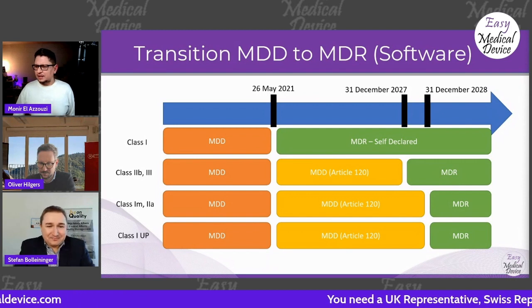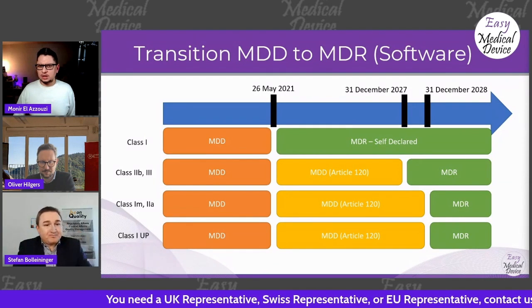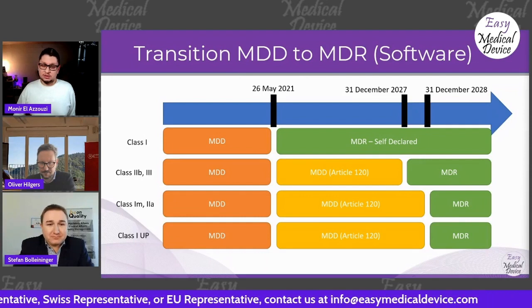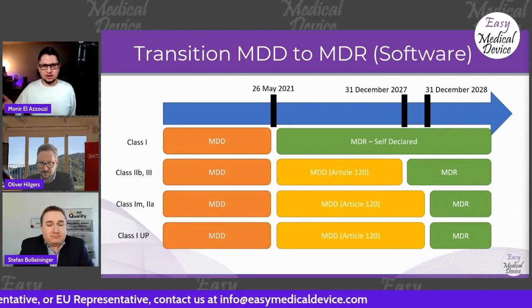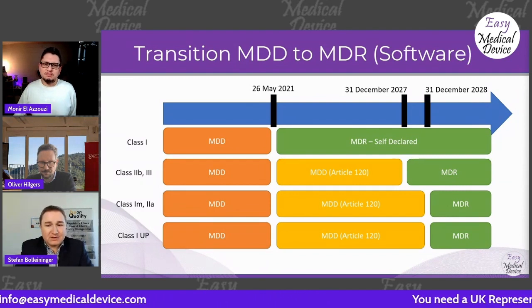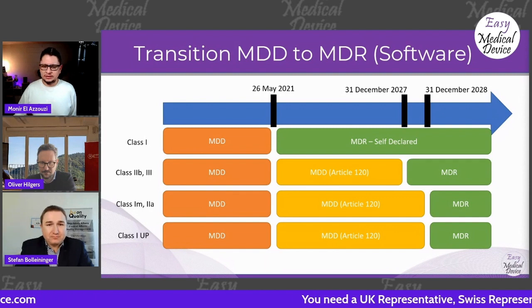Exactly. So what do you think about this transition? We have this significant change. What about software and significant change? Because we know that software can change a lot with a lot of updates. Is this something where software manufacturers should be really afraid? I don't know about afraid. No manufacturer shall be afraid of changes, and shall be afraid of the MDR. It's a task they need to do.